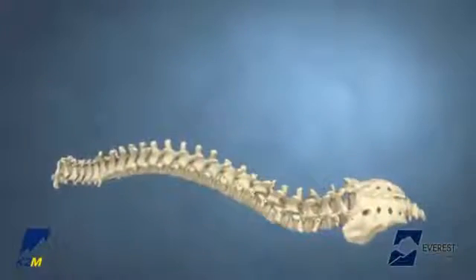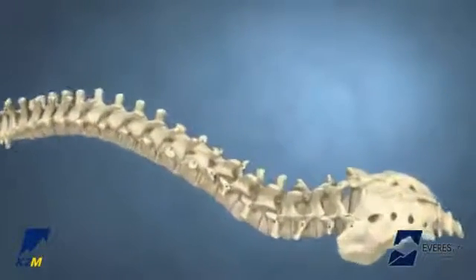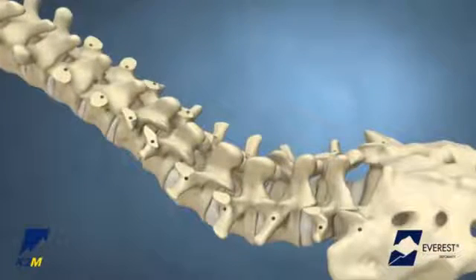The patient should be positioned as appropriate for a posterior approach, taking care to preserve or improve sagittal alignment of the spine. For detailed steps on patient positioning and screw site preparation, please reference the Everest Degenerative Animation.